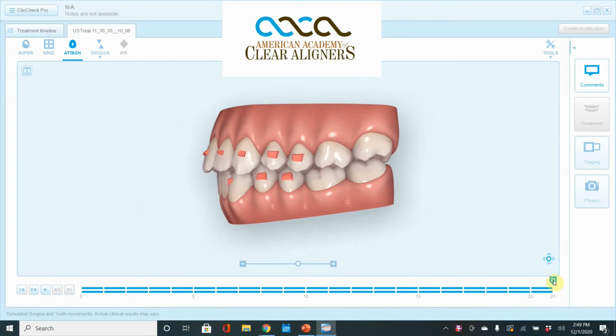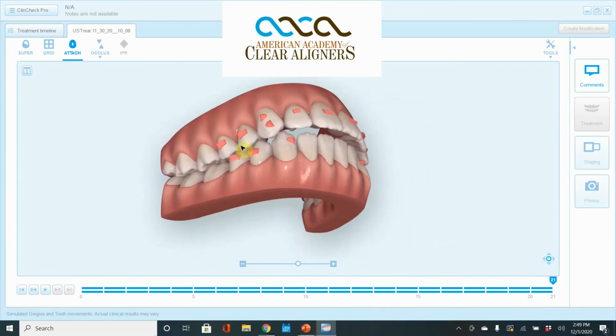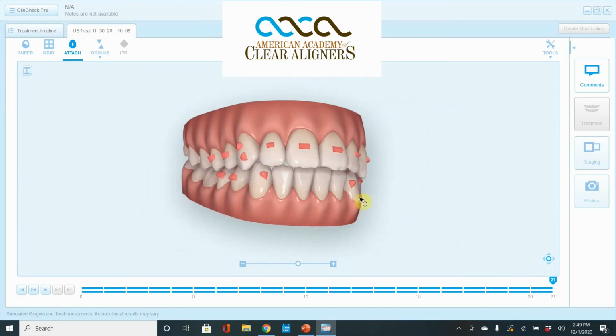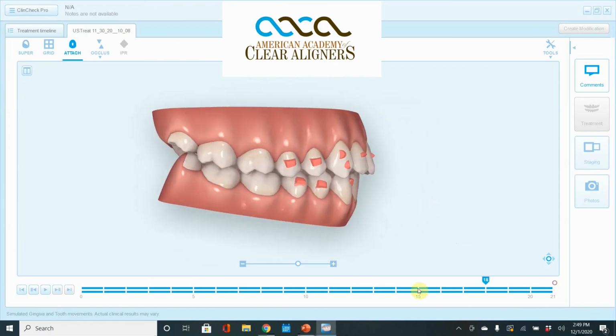Now, we tried to do some relative extrusion. You can see there's definitely some relative extrusion that's trying to be done, but then the teeth are tipping. What this case is missing is IPR. We've got to throw in a solid 0.3 millimeters distal canine to distal canine, and that will accomplish two things for us. Number one, it will close the overjet completely, and number two, it will get rid of that flare.